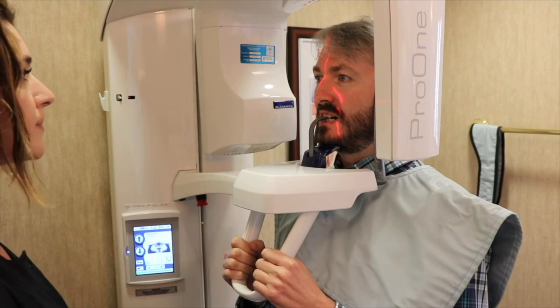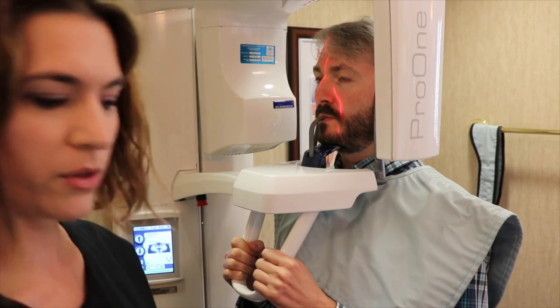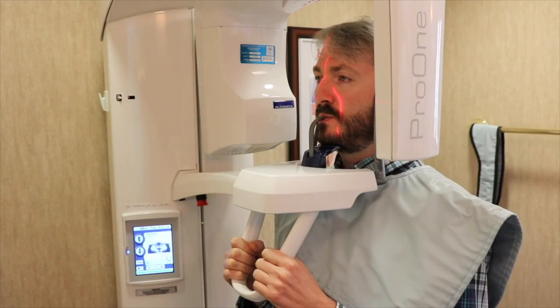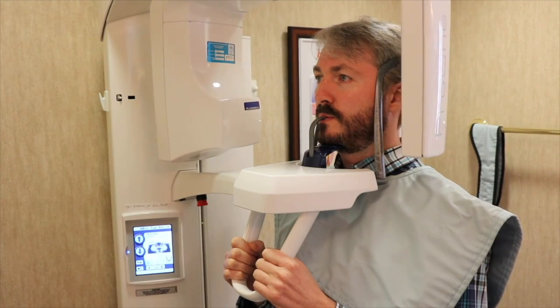Finally, tell the patient to close your lips together and swallow. Then I want you to keep your lips closed, keep your tongue on the roof of your mouth, and breathe through your nose while this goes around your head. As you step away, remind them again to breathe through their nose. Hold down the exposure button.